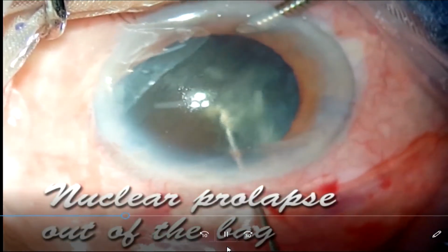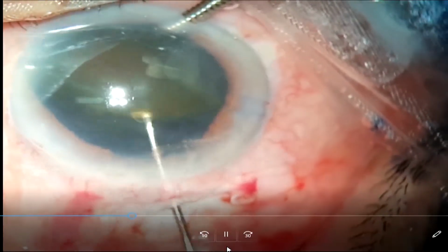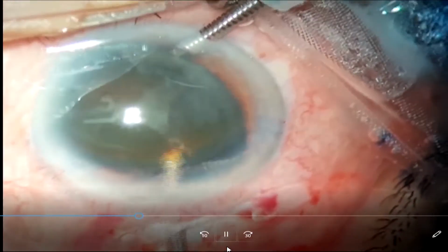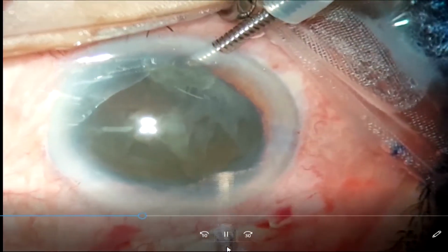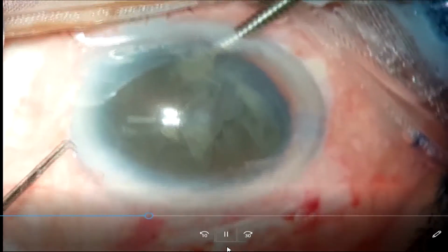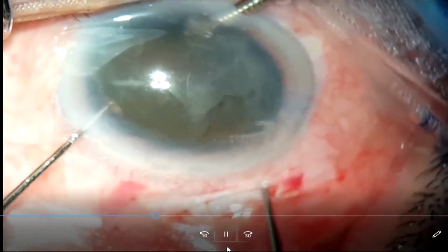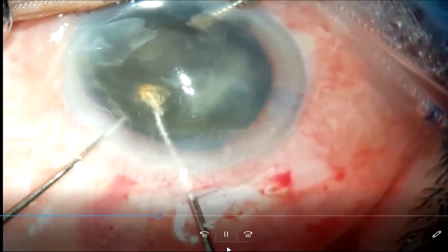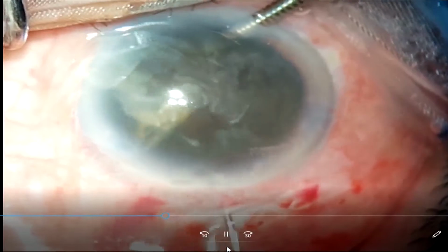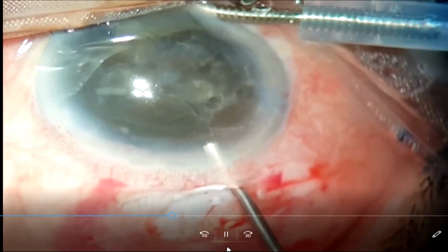This is a SICS hook being used to dial the nucleus and prolapse it out. So once one of the edges is out, you can inject viscoelastic on the surface of the iris that will help in pushing the nucleus out further. You can also use other techniques like the hand over hand maneuver. This is now the hand over hand maneuver being used to prolapse the nucleus out. It is a large nucleus with a slightly smaller rhexis than what it required. So this maneuver helps. And again, lots of viscoelastic in front.